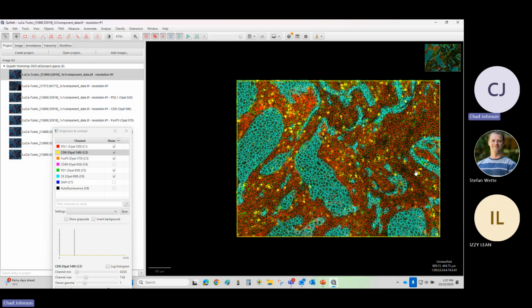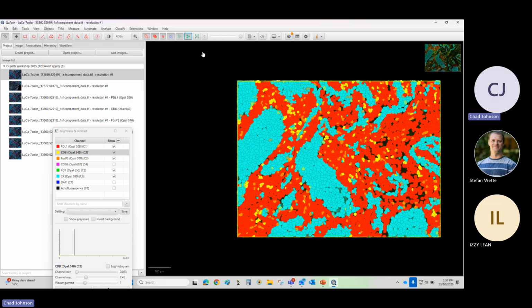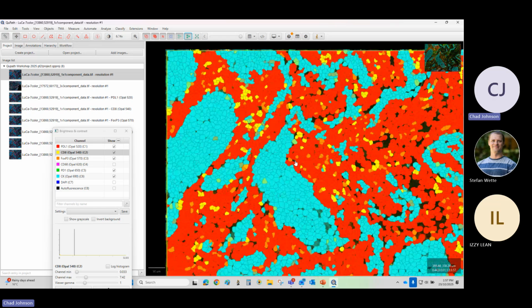Results. So now we have this image, and we can export this image if we need to. You can fill in this using that. If you want something a little bit more striking, you can use that function.